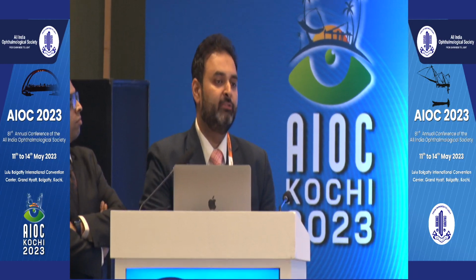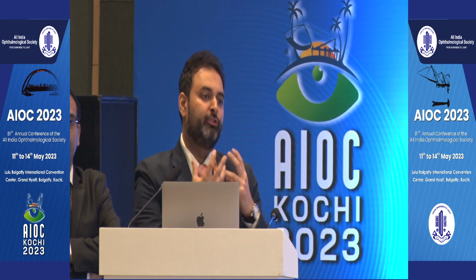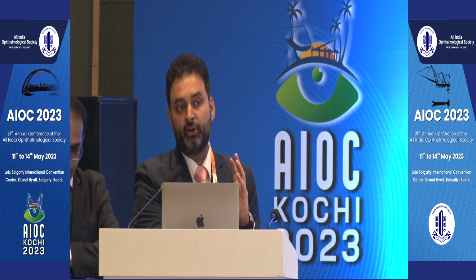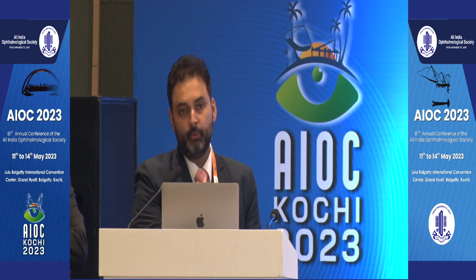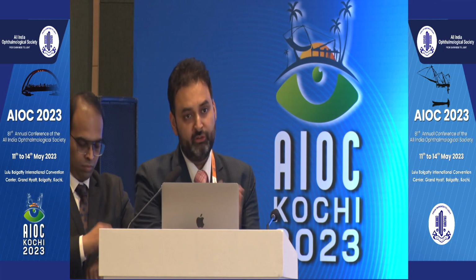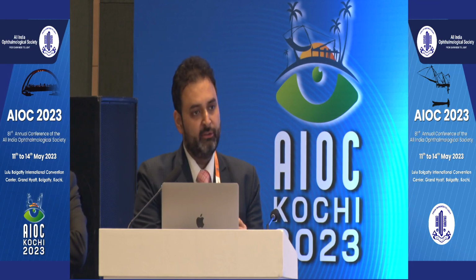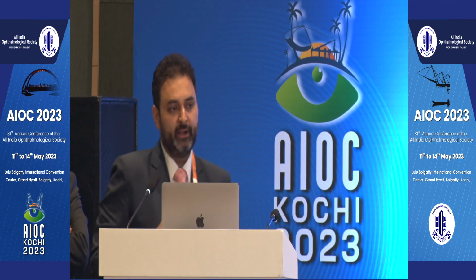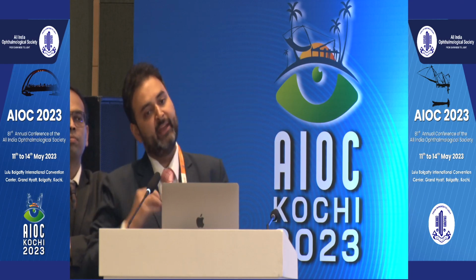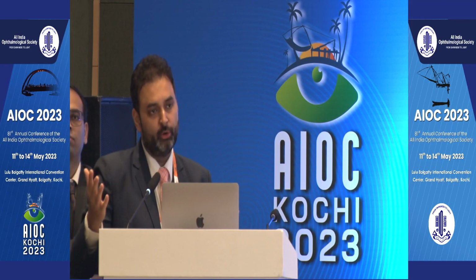But that is one. The second is there is low pressure, either because it was not sutured, which caused the choroidals and all of that. The third is endophthalmitis, because post-vitrectomy presentation of endophthalmitis would be different from, let's say, post cataract. The fourth one, which is unique to these systemically unstable, rather sick patients, and as Raman sir pointed out rightly, is patients with chronic renal failure on renal dialysis, because their body has a lot of fluid overload and can't excrete a lot of stuff. Coupled with that, surgery is an added stressor that sends the whole system for a toss.